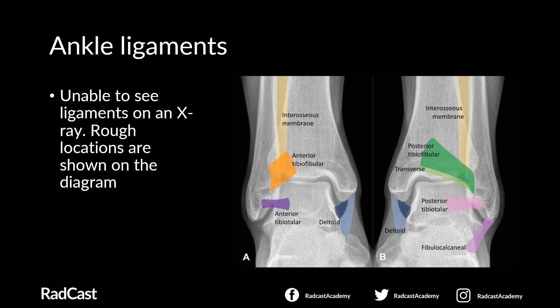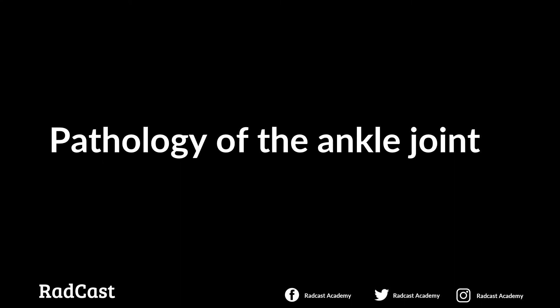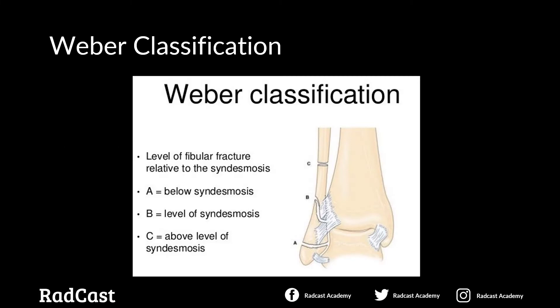If the ligaments are ruptured, this can contribute to the instability of the ankle and allow joint dislocations. Rough ligament locations are shown on these helpful x-rays with the overlying coloured structures. This is important, as if there is a fracture line extending through the ligament insertion sites, you can expect those ligaments to also be disrupted. The easiest way to approach common pathologies of the ankle joint is to look at the Weber classification first. The Weber classification divides fractures into those below syndesmosis, called Weber A fractures; at the level of syndesmosis, Weber B fractures; and above the level of syndesmosis, Weber C fractures. It provides an easy way of categorizing ankle fractures and has implications when assessing joint stability.